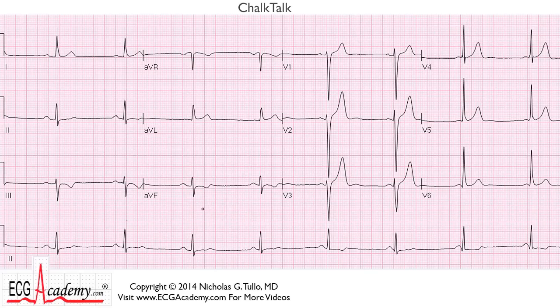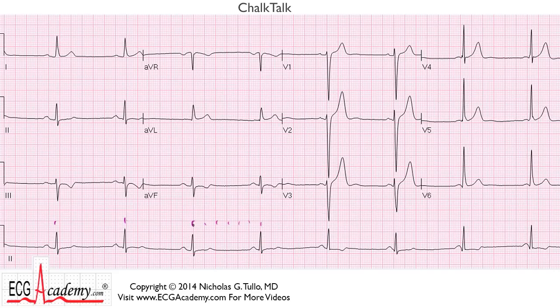Looking down here at the rhythm strip, we can see the rhythm is quite regular. And what's the rate if we count off boxes? 300, 150, 100, 75, 60, 50 — just about 50 beats per minute. In fact, if you see that the QRS is hanging pretty close to the heavy line, so maybe it's like 49 beats per minute.